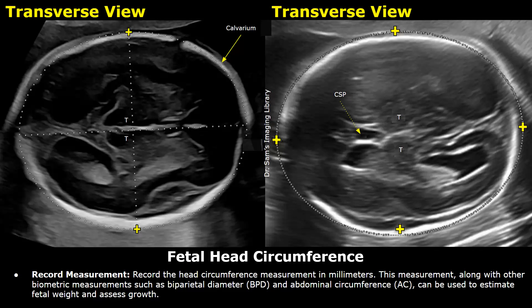This measurement, along with other biometric measurements such as biparietal diameter and abdominal circumference, can be used to estimate fetal weight and assess growth. It is recommended to repeat the measurements a few times to ensure accuracy and consistency.